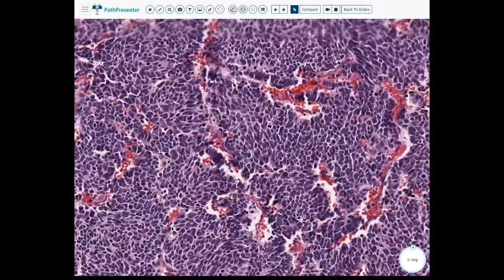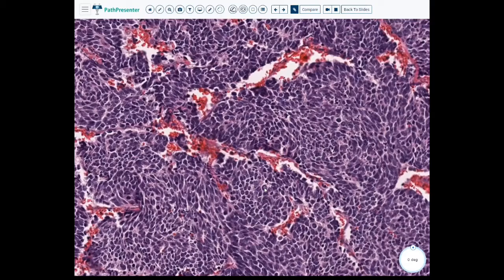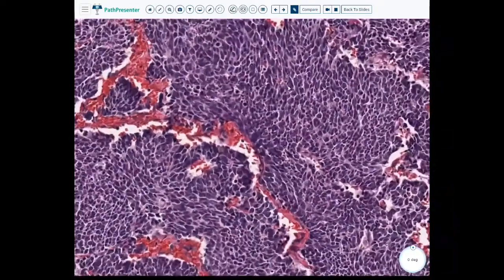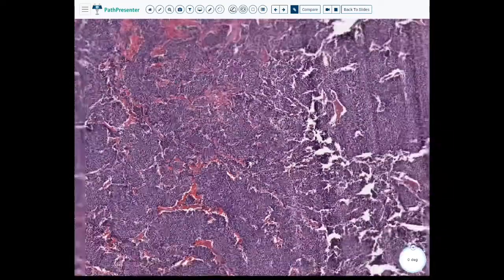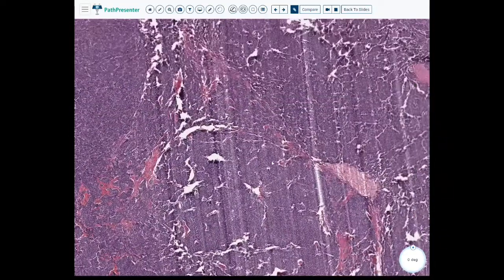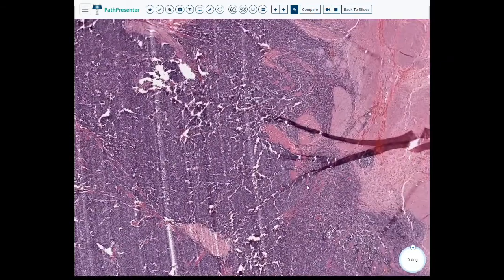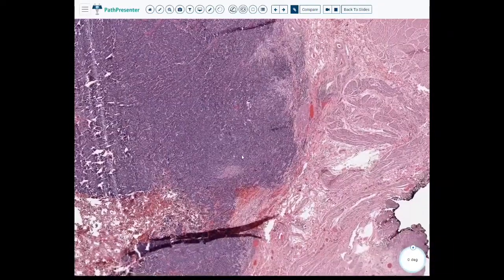So again, just spend some time looking at these cases. Maybe one nucleoli, but one nucleoli in a sea of cells, that's okay. Lots of apoptotic figures up here. And remember the things that we talked about in the previous case: the TERT mutations, TP53 mutations, the poor prognosis. These patients with true small cell carcinoma of the bladder are going to get cystectomy or radical cystectomy or cystoprostatectomy.